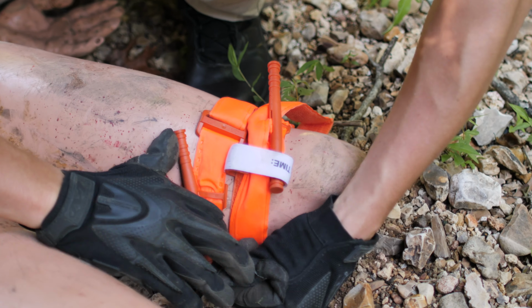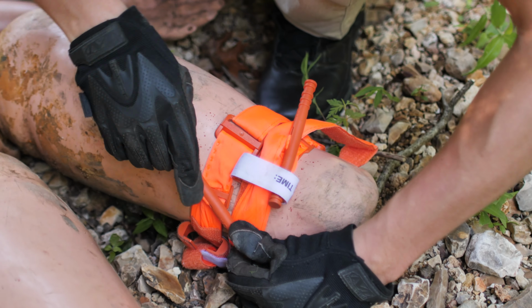The time frame we're looking for when we do a tourniquet conversion is less than 2 hours after that tourniquet is applied. Now remember, those tourniquets have the little cool straps that help hold that windlass in place, and you're supposed to write the time on it. Well, there's a reason for that, because there's a lot of things that are based off when that tourniquet was applied. So it's important when you put one on, if you can, put that time on there. Now we have a reference to go off of to say, hey, can we do a tourniquet conversion on this person if they need it?